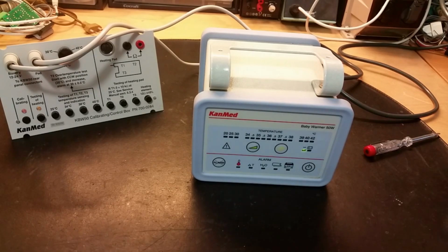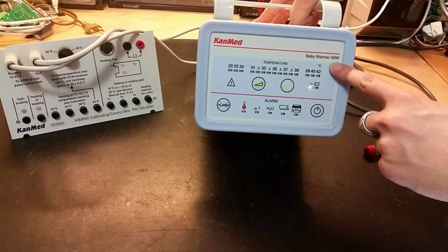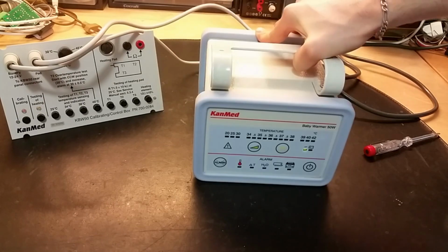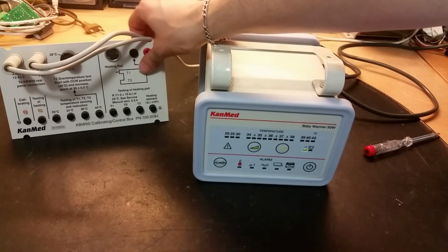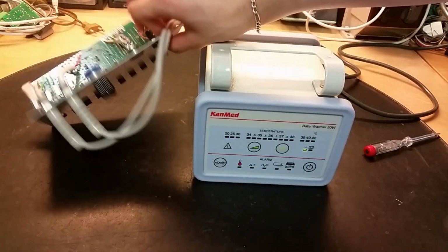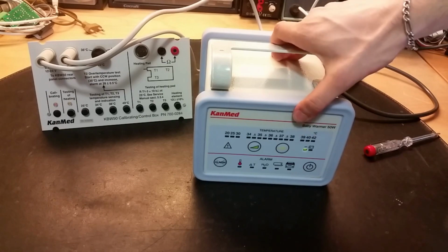Yes, another medical equipment teardown. This time we got a KanMed baby warmer, 50 watts. We got this heating pad, or actually that's not a heating pad. This is just a test unit. And yes, well, let's have a look at it and see how it works.